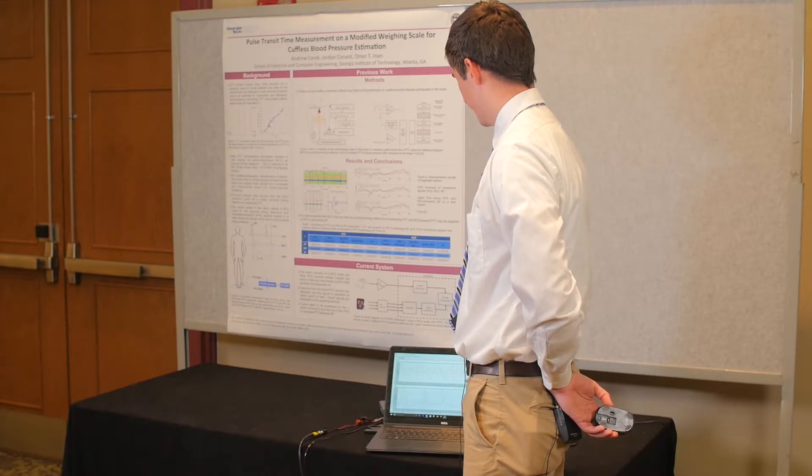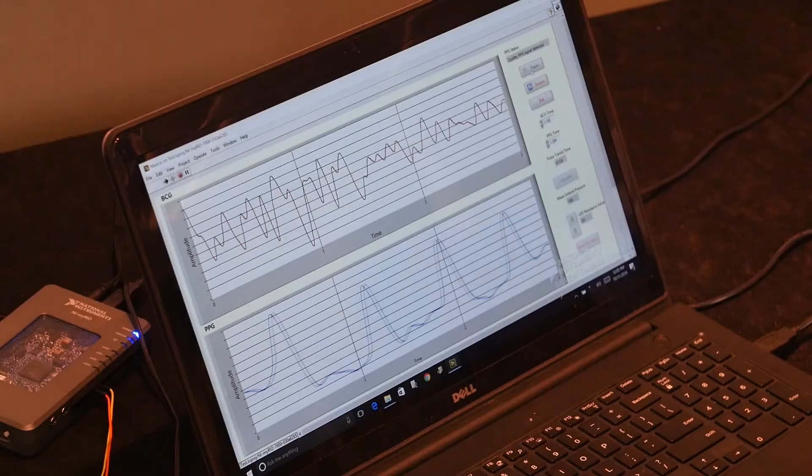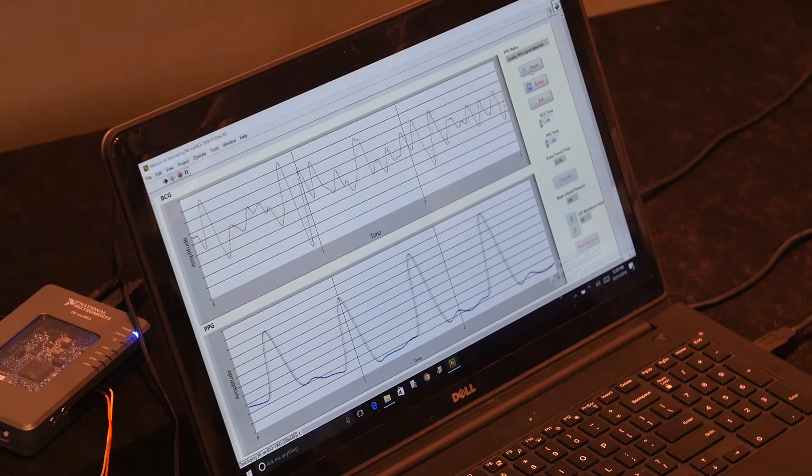Right now we have the system recording both the BCG and the PPG. The signal on the top represents the BCG, and the one on the bottom is the PPG.